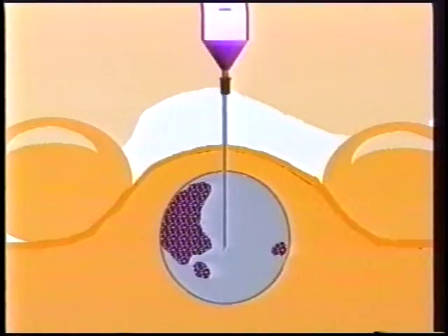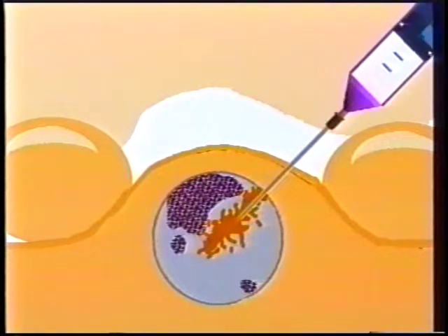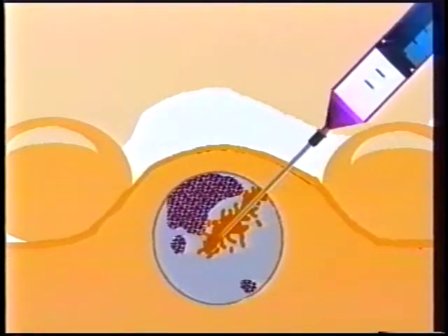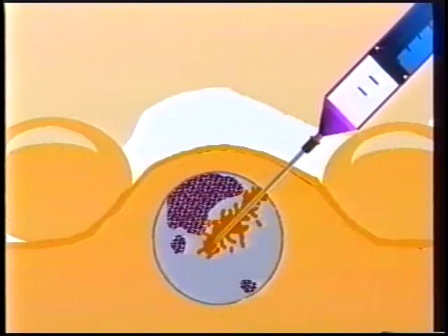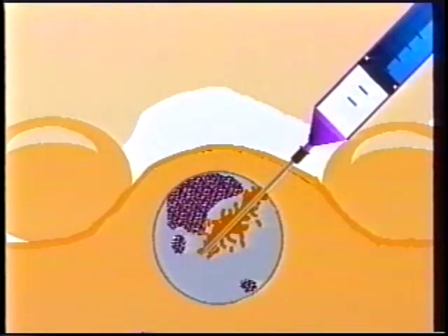If the angle of the needle is changed substantially while deep within the mass, it will push the nodule to the side and possibly tear the tissue, but not effectively sample a different area. This maneuver is likely to cause unnecessary bleeding and discomfort. Redirecting the needle while sampling is time-consuming, and it makes it more difficult to assure that the needle is placed well within the target. Therefore, I would suggest an easier way to take a sample.